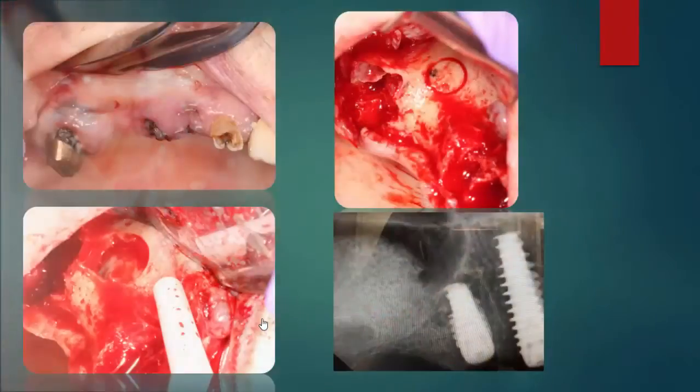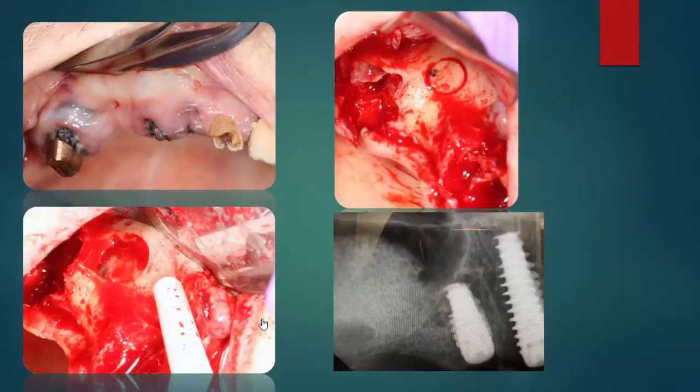هلا رح نشوف حالة تانية لأكسترنال sinus lift. مثل ما شايفين، we have decayed remaining root على premolar, badly decayed molar. فالتريتمنت بلان كانت إنه نعمل extraction للpremolars والmolar ونعمل immediate implant placement مع الاكسترنال sinus lift.